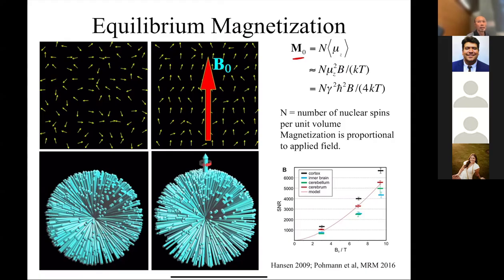But do your cells care if I'm facing this way to the magnetic field or not? Yeah, that's a great question. So that gets to the safety of MRI. As far as we know, just being in a high magnetic field, at least the ones that are most commonly used, no one has determined any long-term effects of that. It's every proton in your body being affected, right? In a probabilistic fashion.